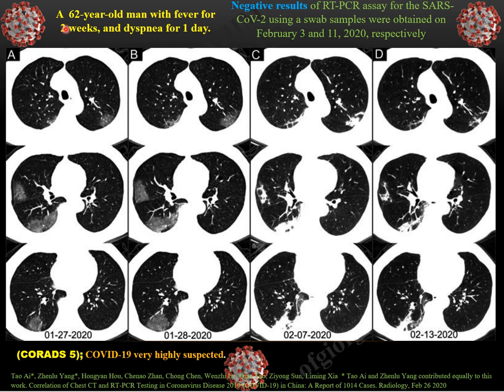Another patient, 62 years old, with a negative result also, showing multifocal consolidations with an increasing and progressive course on different subsequent studies, appearing in the last studies as organizing pneumonia, with cavitations and consolidation transformation of the ground glass opacity. At the first diagnosis, we classified it as CO-RADS 5 because COVID-19 was very highly suspected. However, fortunately, this patient also had negative results on 2 subsequent days, 3 and 11 February.